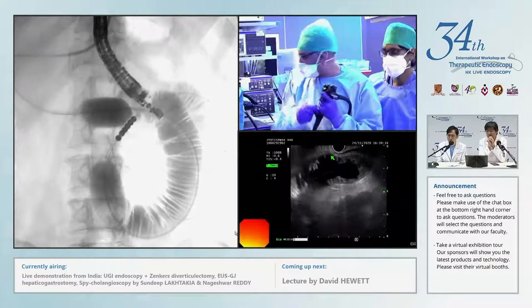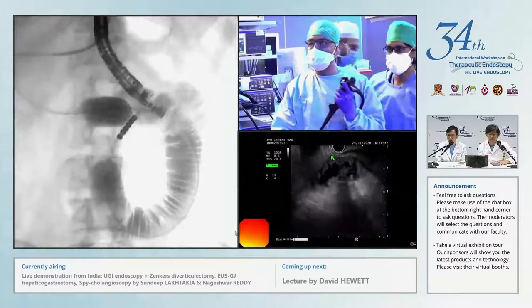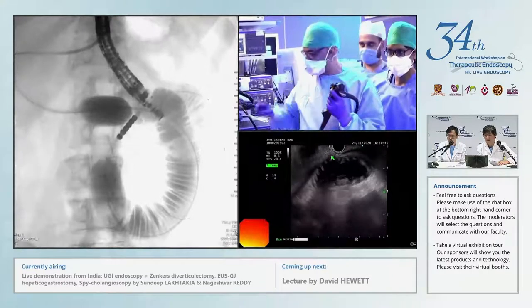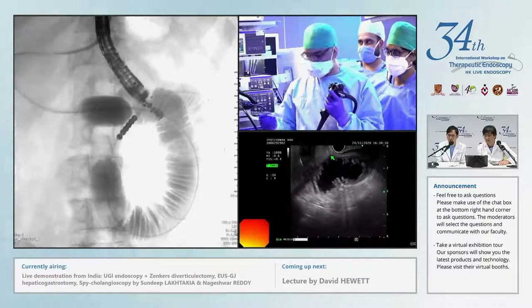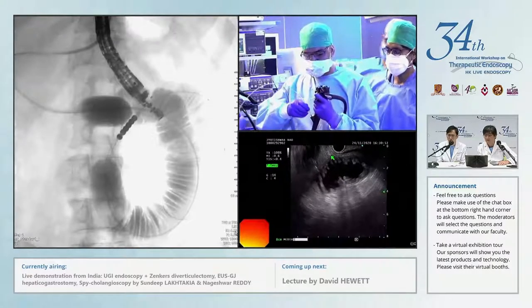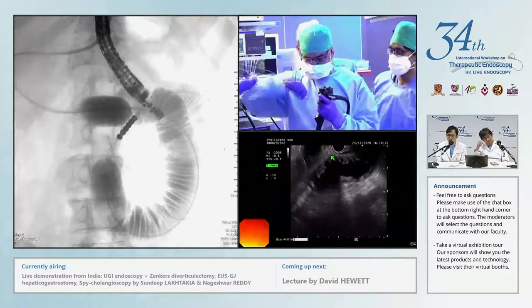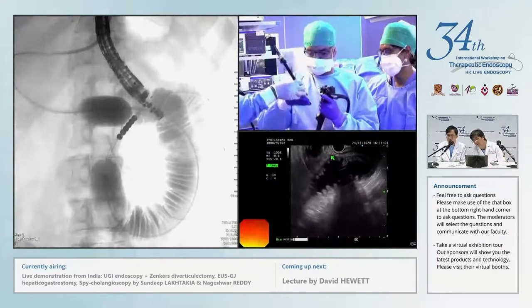So can you have the stent now? Using an Axios stent, Hot Axios, of 20 mm caliber. Wet the entire sheath. The external sheath has a hydrophilic coating, so it is better to make it wet so that it passes easily.